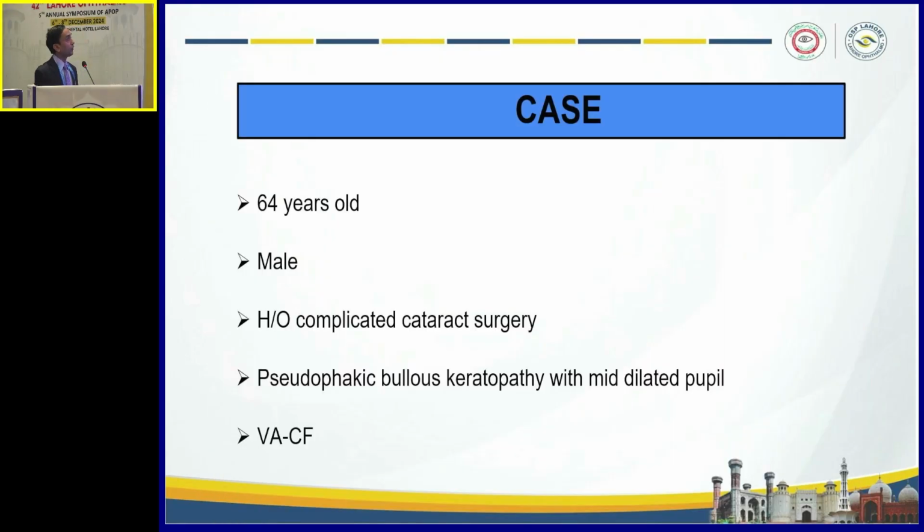My case: a 64 year old male who had complicated cataract surgery and developed pseudophakic bullous keratopathy with a mid-dilated pupil. His vision in the left eye was counting fingers.